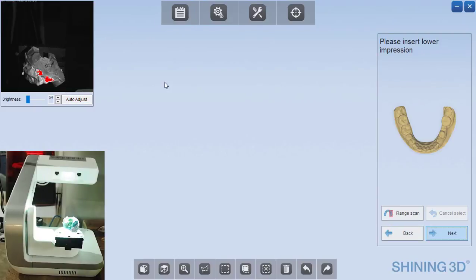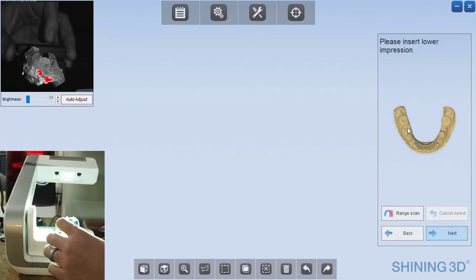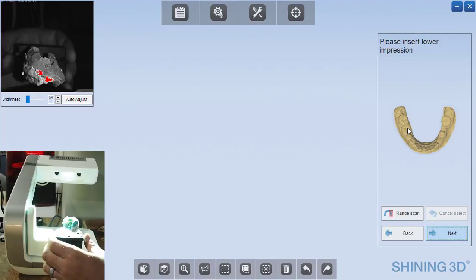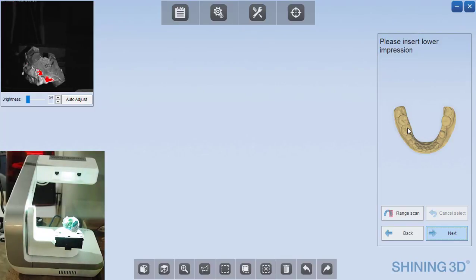You can see the viewfinder in the upper left and the software tells me that I need to insert the lower impression, so that's actually how I have it oriented already. And I can click next.